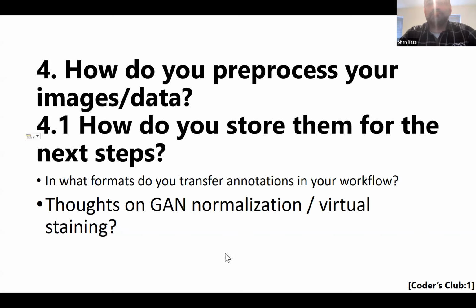Yeah, what do people use to convert their slides to DICOM? Does anyone have software that they use? The only one that I found is put out by Orthanc, which is a DICOM viewer for radiology. They have a DICOMizer in C++. There is one from Sectra. I think Geert might. Yeah, Geert has just put the link there as well. So yeah, there's one for DICOM conversion. Okay, I'll take a look at that.